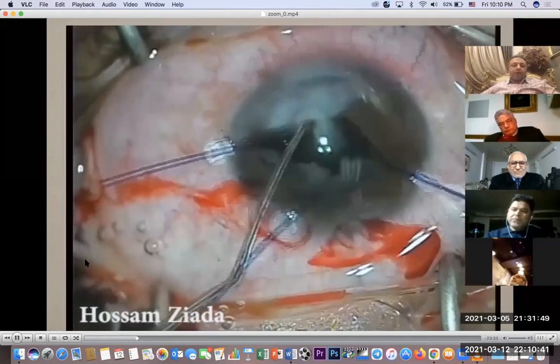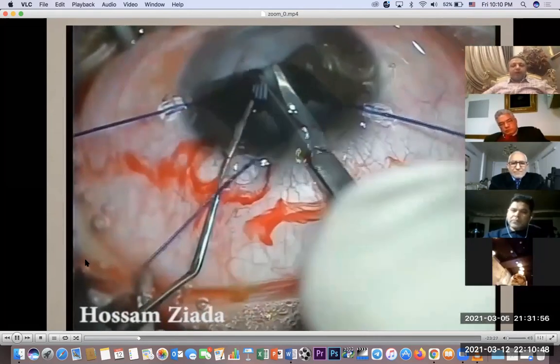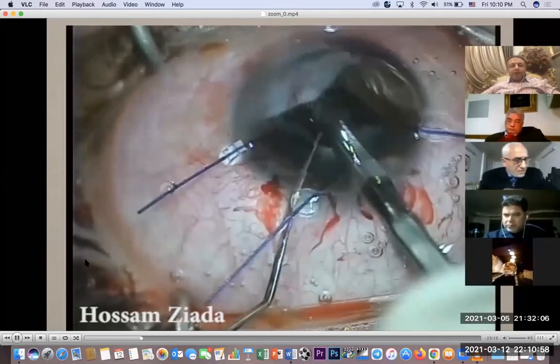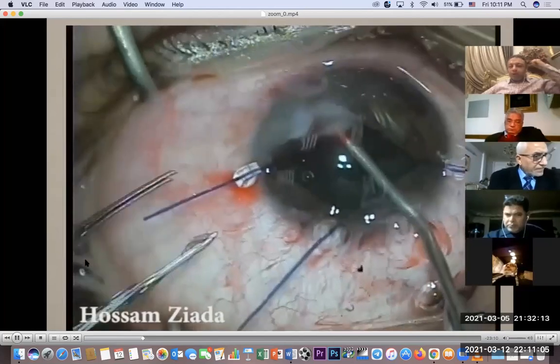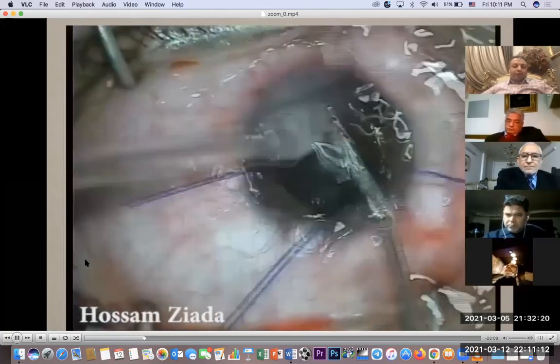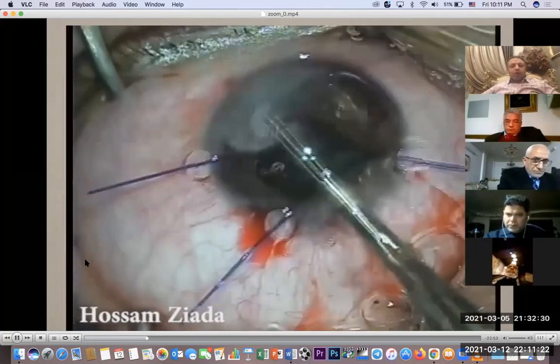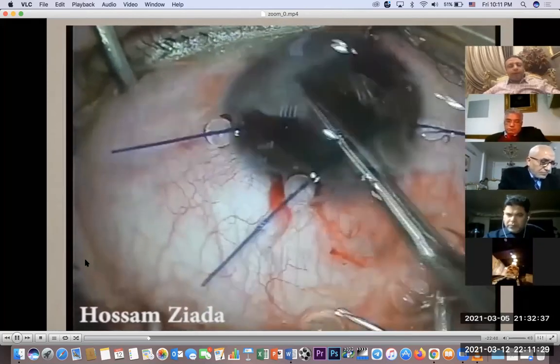I'm trying to find another edge to complete separation of this. I'm going below this membrane, trying to separate it from the anterior capsule, but actually it was very thick and very adherent, and these fine instruments didn't do any job with this huge and thick membrane. I'm trying again to separate it together with injection of the viscoelastic to protect the endothelium. I'm trying again. So I'm trying to stretch it and to peel it from the back of the cornea, then to peel it again from the anterior surface of the iris.